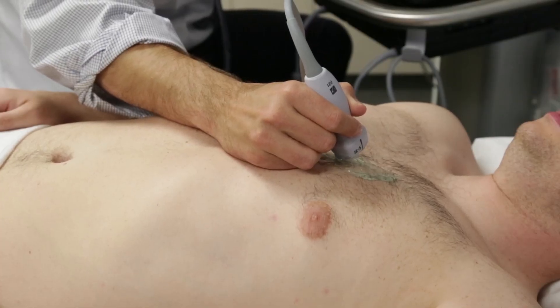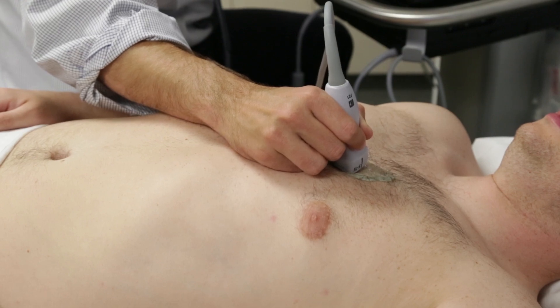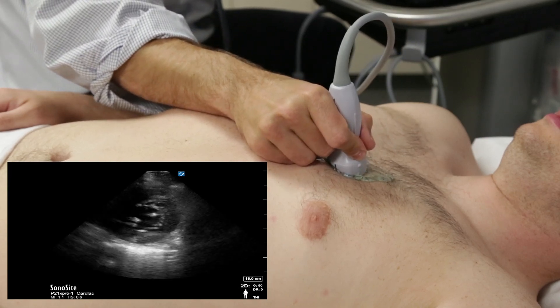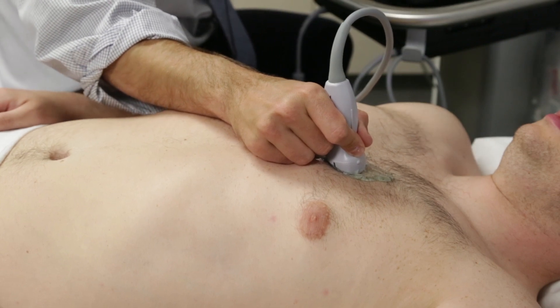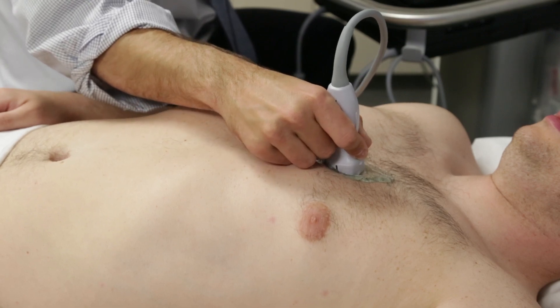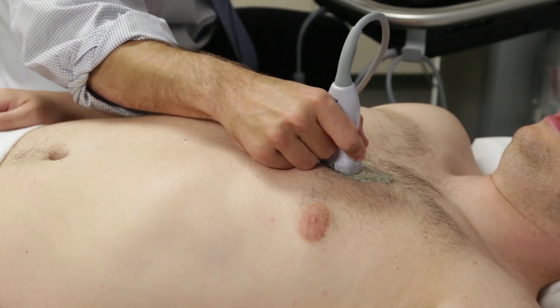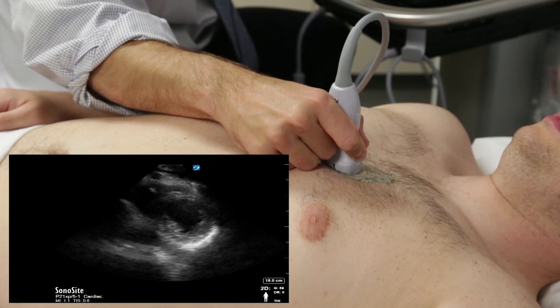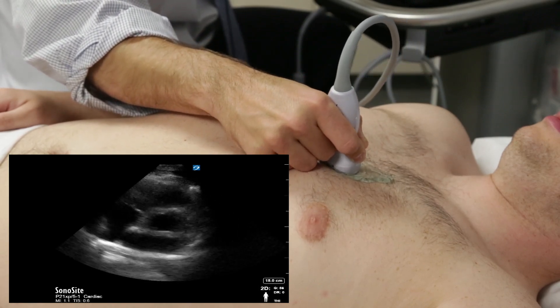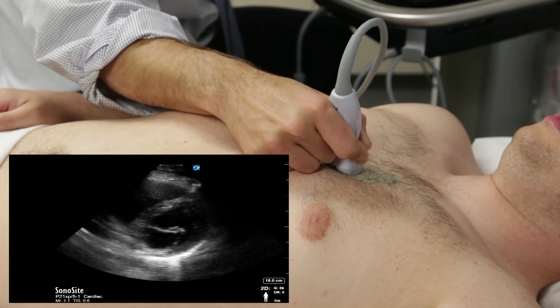We now move to the parasternal short axis view. The most effective way to transition from the parasternal long axis view to the parasternal short axis view is to rotate the probe 90 degrees clockwise so that the probe marker is now pointing to the patient's left shoulder. The probe should not move from its position on the chest other than a simple 90 degrees clockwise rotation.